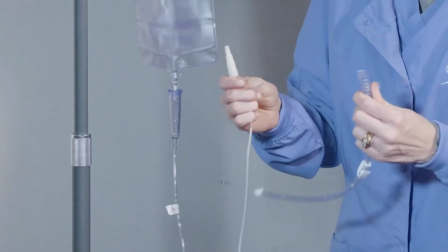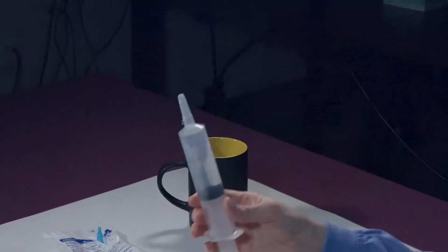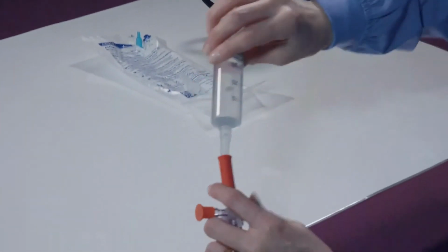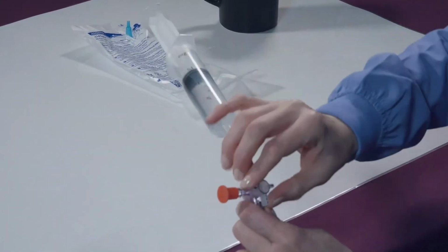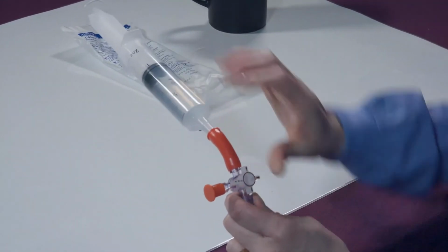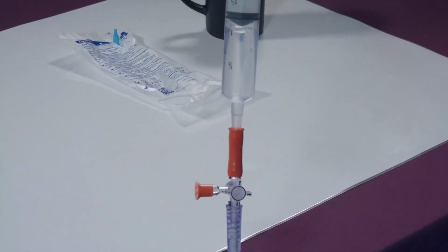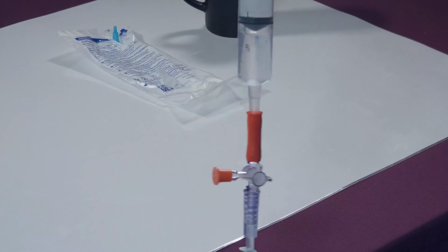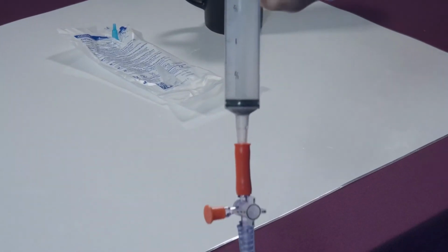After your feeding, you will need to flush your feeding tube to clear the tube of formula. Start by filling your syringe with water as directed. Attach the syringe to the tube or valve connector. Unclamp your tube, or if using a valve connector, open the valve and slowly inject the water into your tube. Next, clamp the tube or close the valve and remove the syringe.